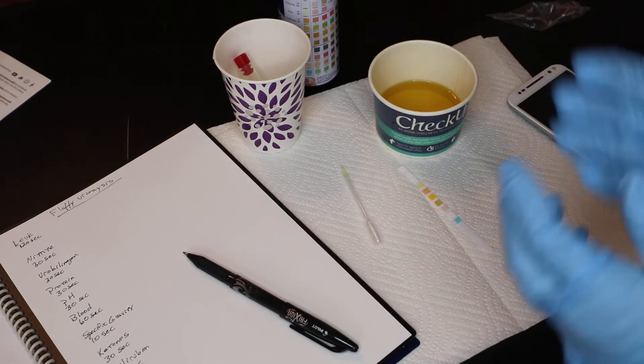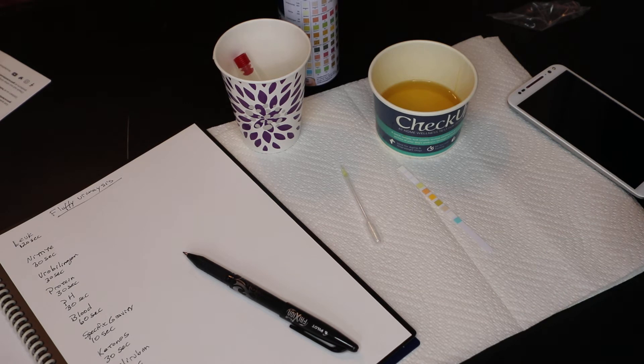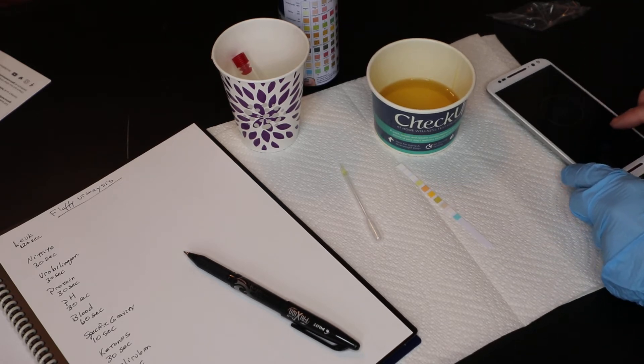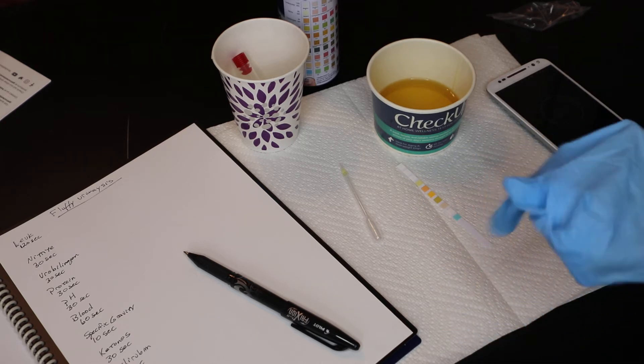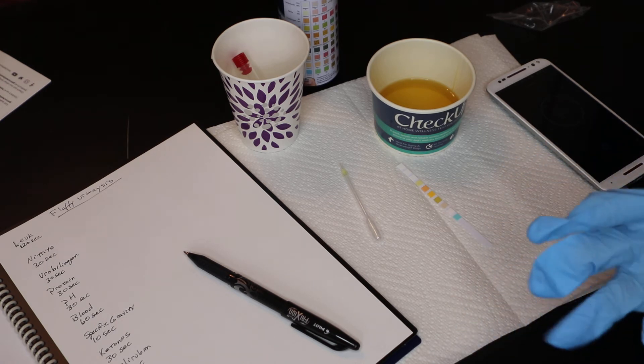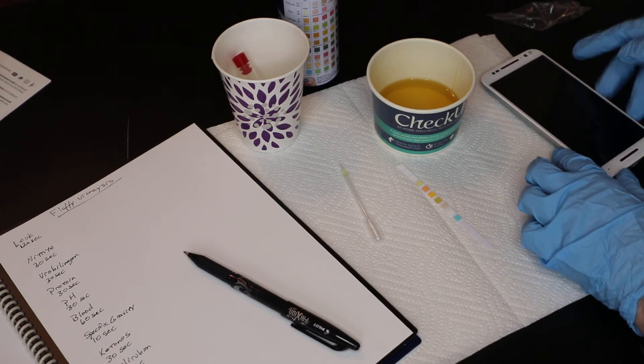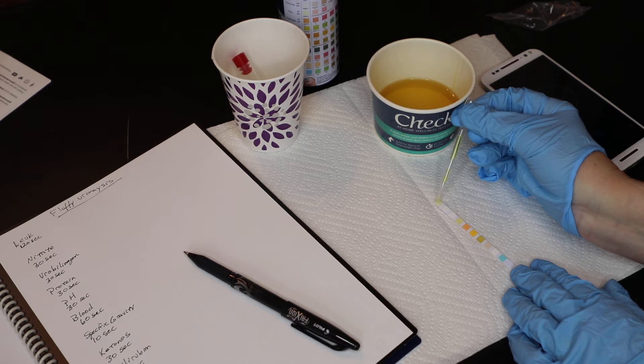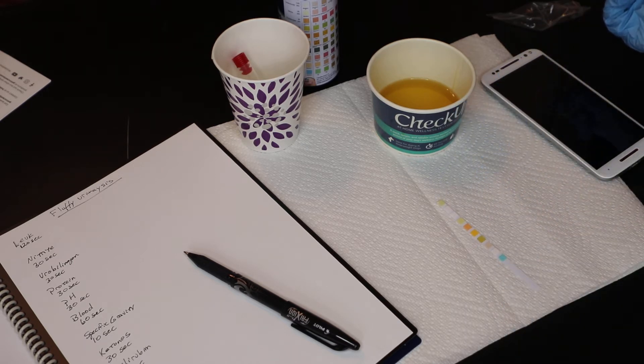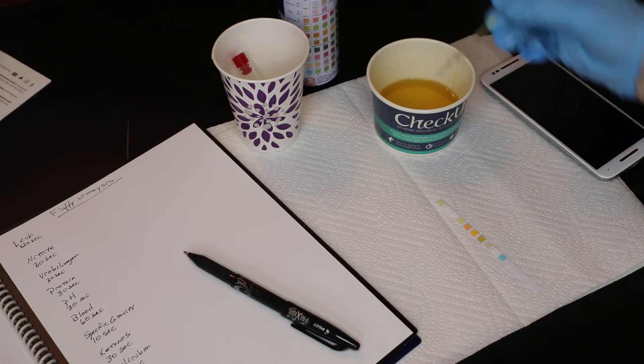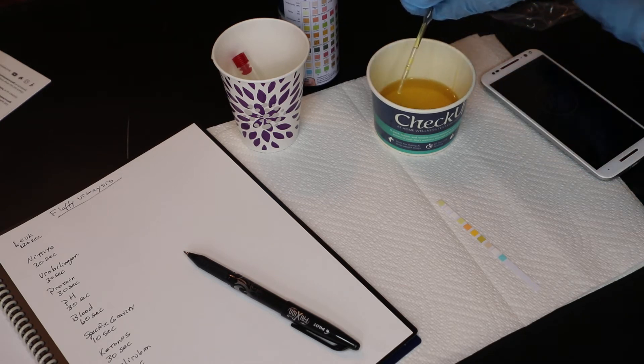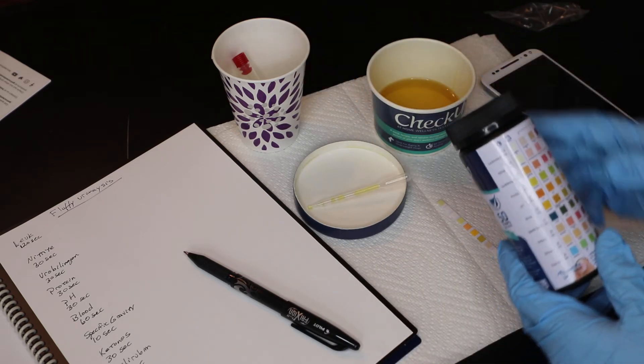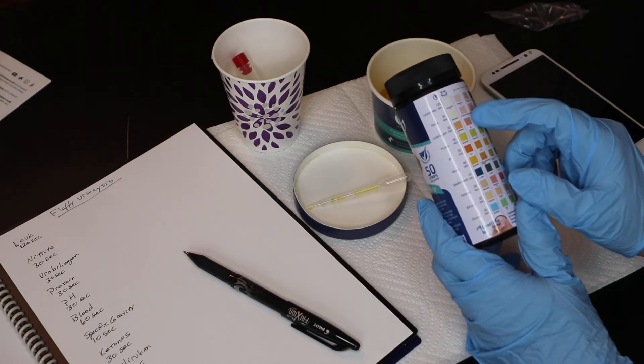So to start the urinalysis, first I'm going to get a timer here on the phone. And I'm going to start that timer and note when it starts. You may have a specific timer that does 30 seconds or 60 seconds. That's ideal. Or you can use the phone timer. I'm going to start that timer and I'm going to do the first pad and place a drop of urine on that first pad. I'm going to let that run 120 seconds. And once that's reached 120 seconds, I'm going to read the first line, which is leukocytes at 120 seconds.